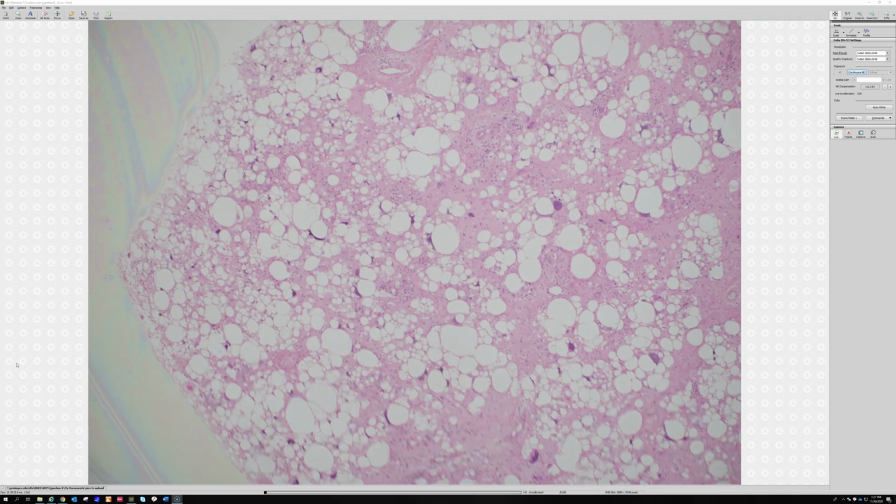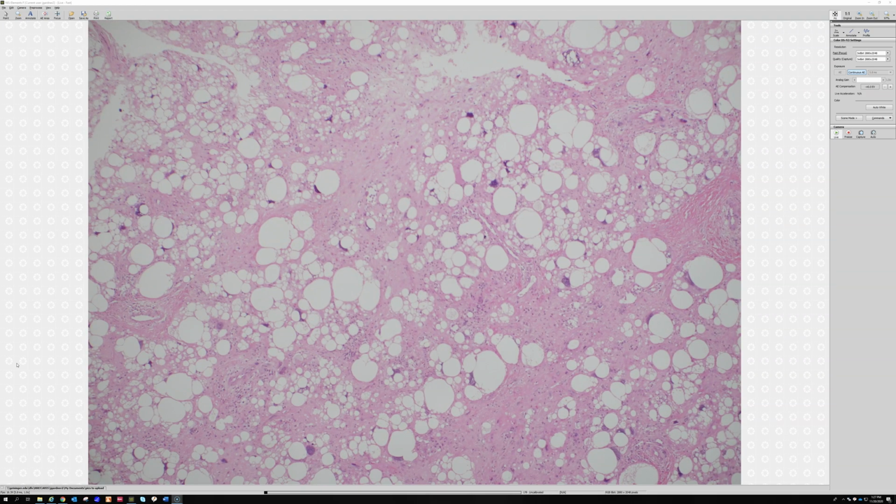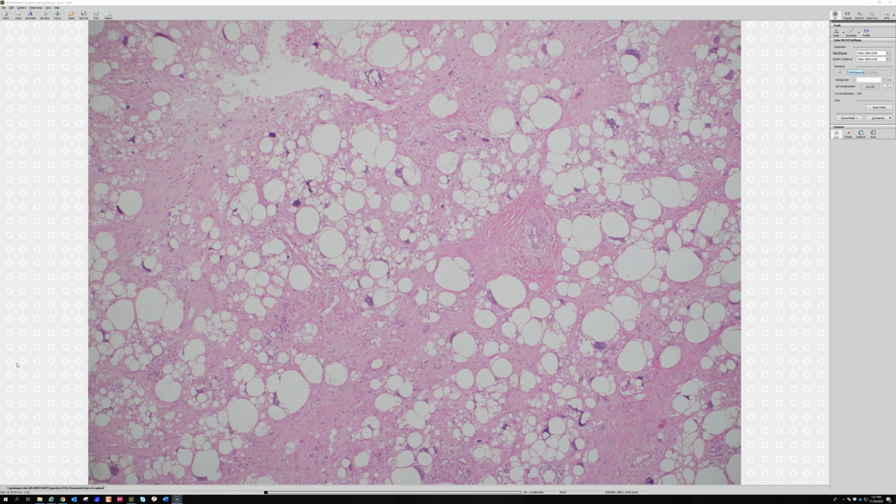There's occasional mitoses, but the alternative is you could think, well, maybe this is de-diff that just has a ton of lipoblasts. Most of the time, de-diff liposarcoma surprisingly does not have lipoblasts. There are exceptions to that rule, but in general, de-diff liposarcoma tends to look like high-grade sheets of pleomorphic spindle cells, just like an undifferentiated pleomorphic sarcoma, but growing next to or at the same site as a well-diff liposarcoma, where a well-diff used to be, or right next door to a well-diff liposarcoma.